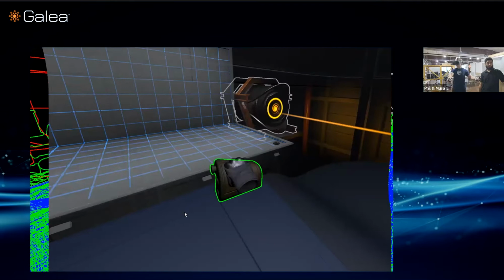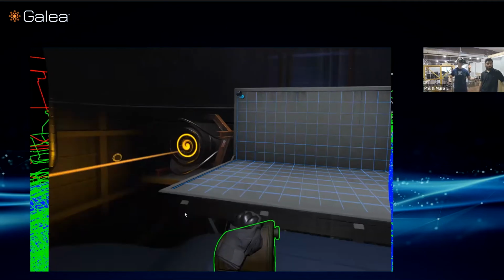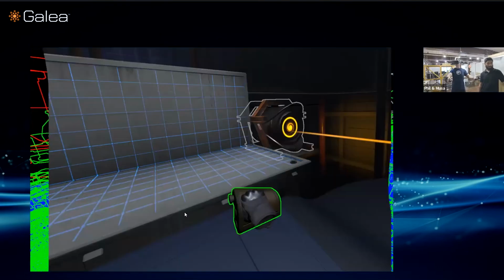So I'm going to grab a better piece that I like a little more. This is a good one. And here I actually like this, so I'm going to go ahead and place it using an eyebrow movement. We have these new buttons that we've added. They're kind of like face buttons. That's a good way of thinking about them.